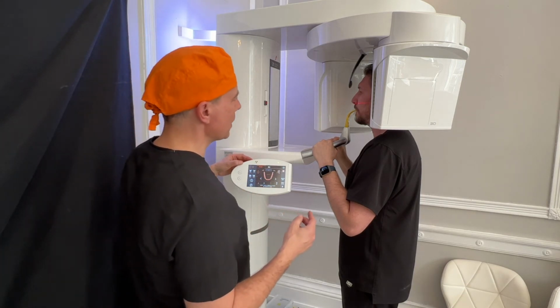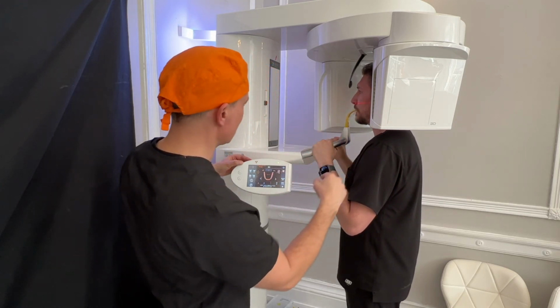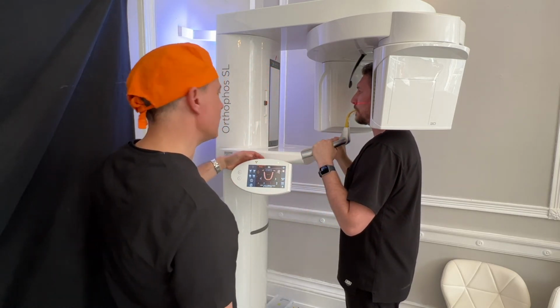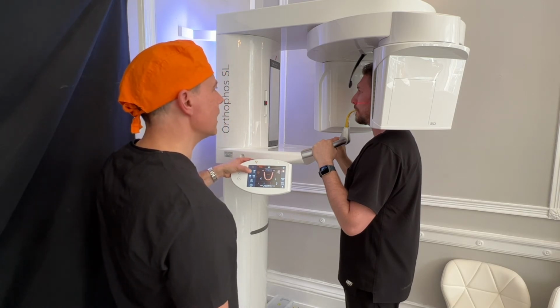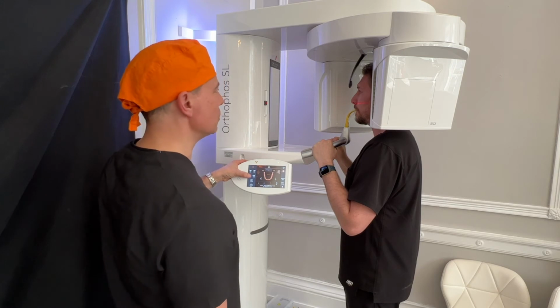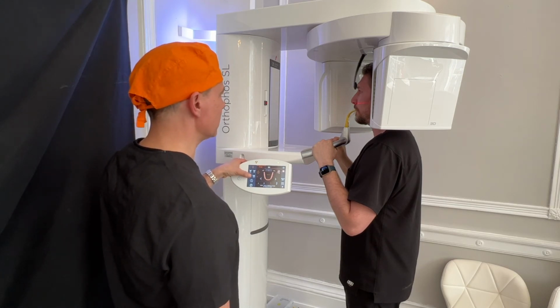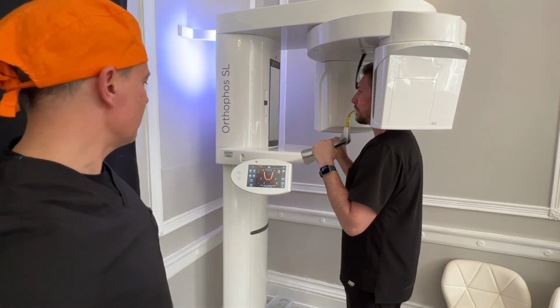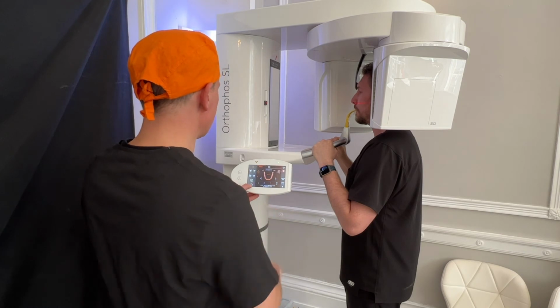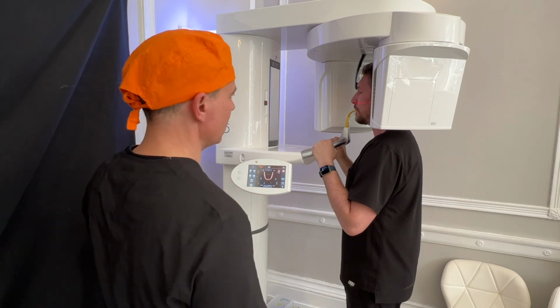Next thing we want to do is to make sure that the patient lines up correctly. We have the horizontal plane here, so we see that it's all looking tidy. So I think we're happy with that. We're going to close these supports, Adam, just to steady your head. Of course, just like any picture, we don't want the patient to be moving about too much, since that can make things blurred. So we can see now that it's just giving us enough here. We press the return button, and then the exposure is ready to go.